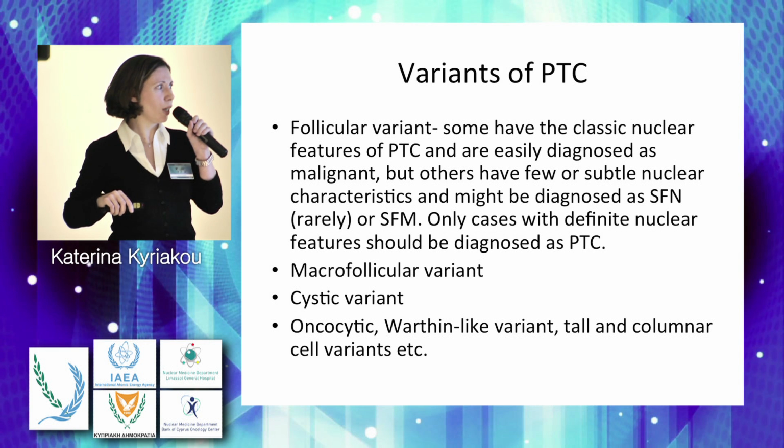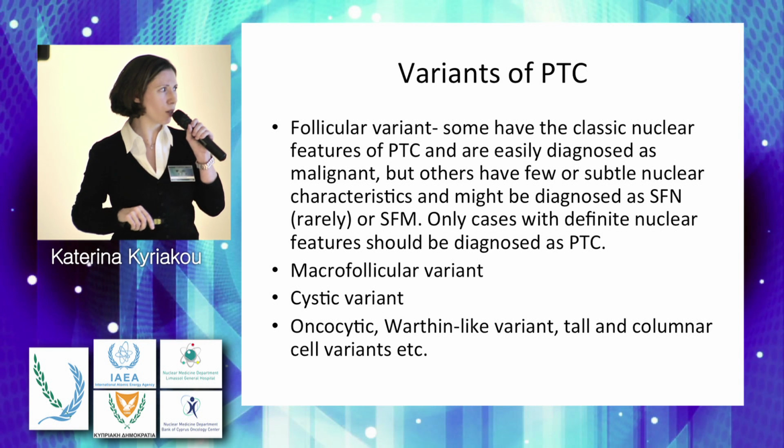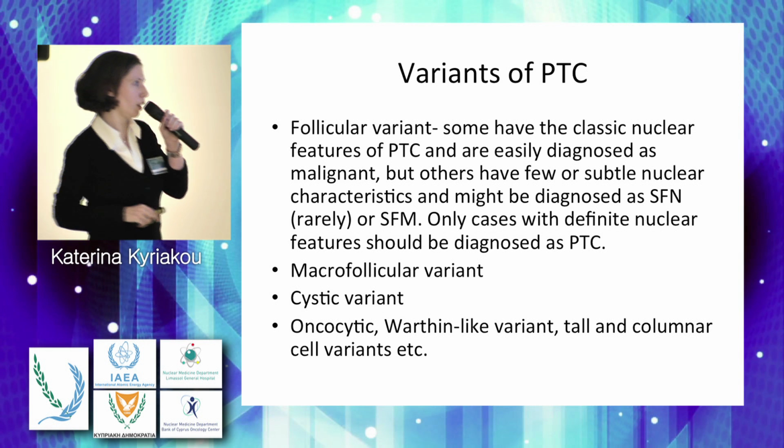We have the macrofollicular, the cystic variant, the oncocytic, Warthin-like, the tall and columnar cell variants, which cannot be diagnosed cytologically. These are histological diagnoses.